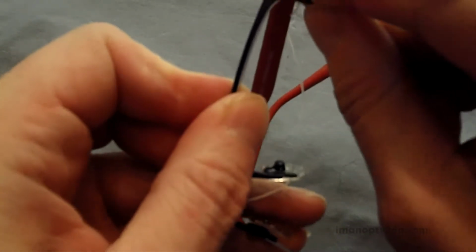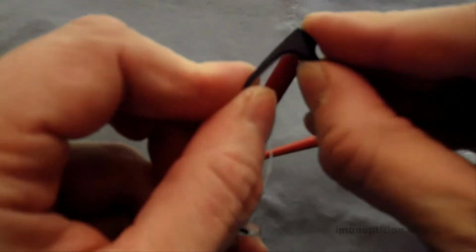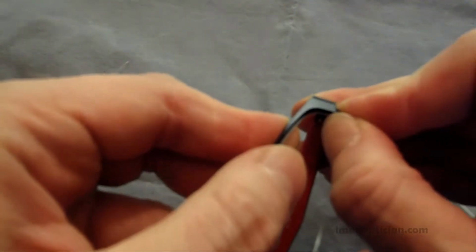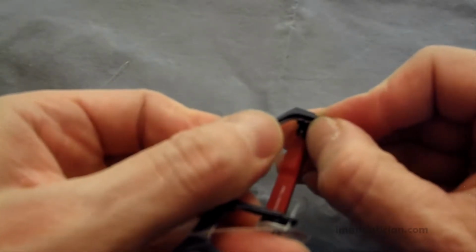That got a little too big here, and you can see how it overlaps. Now if you want, you can just snip it off, or you can pull it out. I'm just going to snip it off because it's quicker. And get in there and just snip that end off. And again, you don't want that tag to overlap. You can see that it just comes up to but does not overlap the figure 8 liner right there.